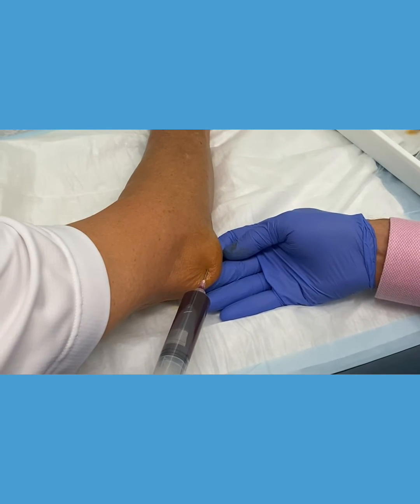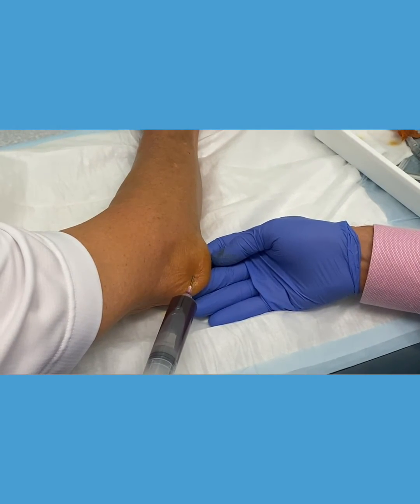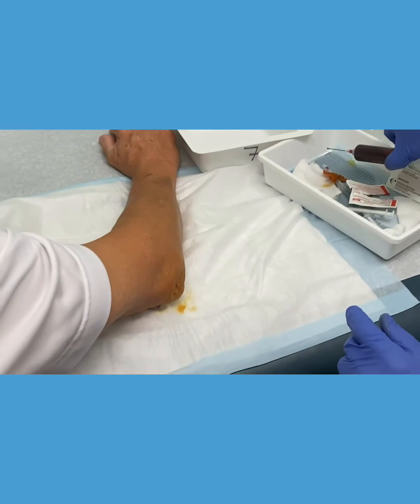You still okay? I'm fine, thank you so much. And there we go — bloody traumatic olecranon bursitis.